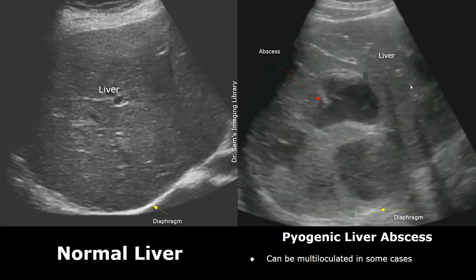Sometimes an abscess may be multi-loculated. Locules are compartments separated by thick walls. In this image, the abscess appears to have three compartments or locules separated by a thick wall.